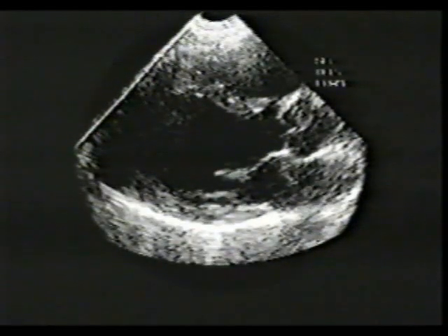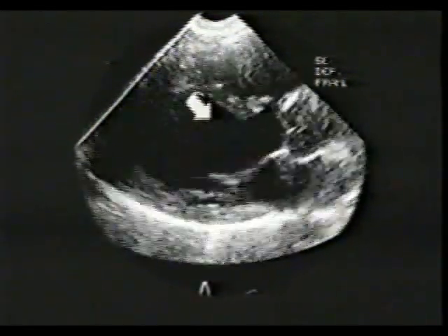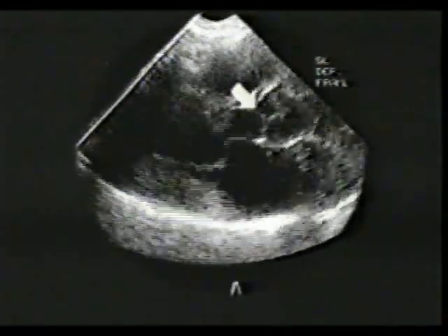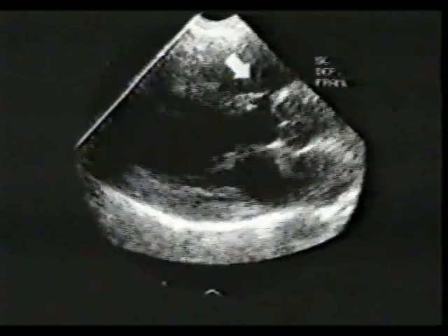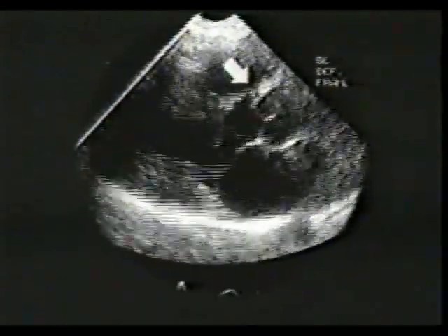This is the parasternal long axis view of a 37-year-old patient with the perimembranous ventricular septal defect. Left ventricular cavity is dilated while systolic function is normal. The large perimembranous VSD can be seen right here, which is partially covered over by an aneurysm formation of the membranous septum.